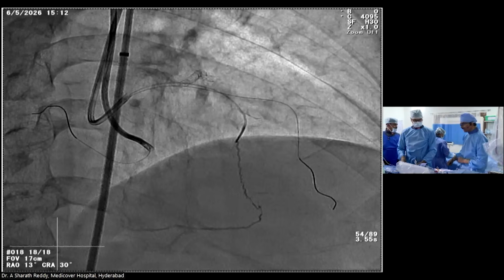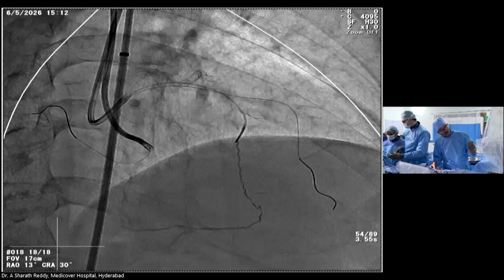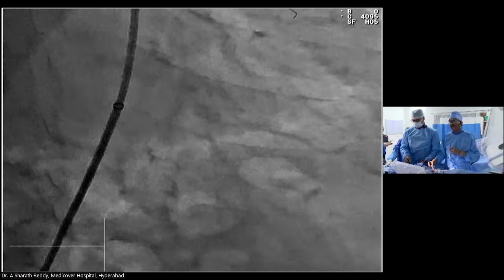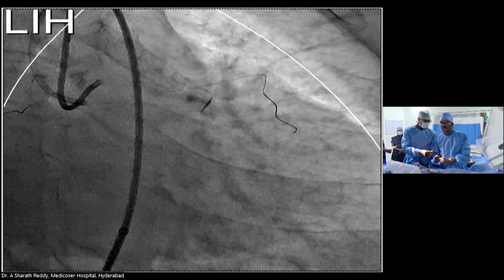Please keep it ready. I would a little bit disagree with your opinion that this is not ideal for antegrade IVUS. Other than if it's retroflected, the IVUS will go. But you should not use a short tip Volcano. That is the biggest story. The short tip Volcano is bad for side branches because it doesn't get in. So quickly review what you had done.